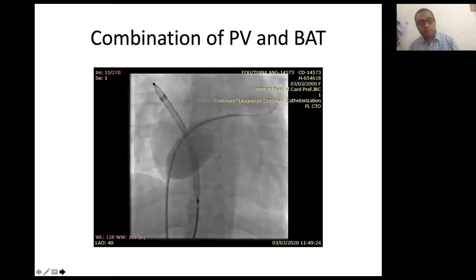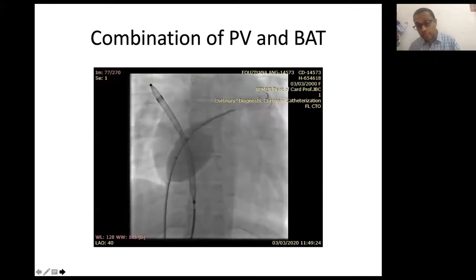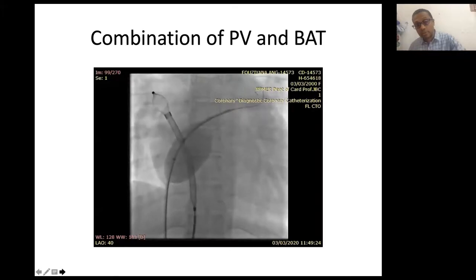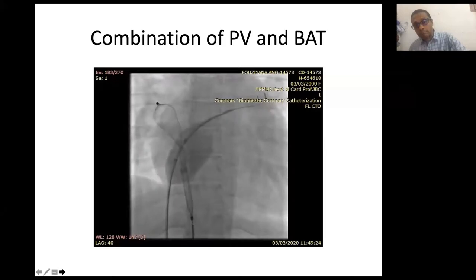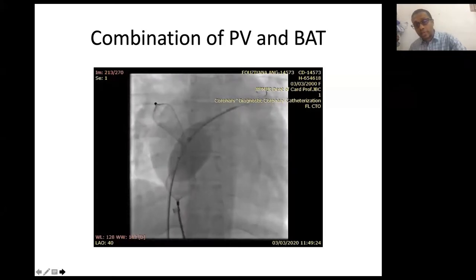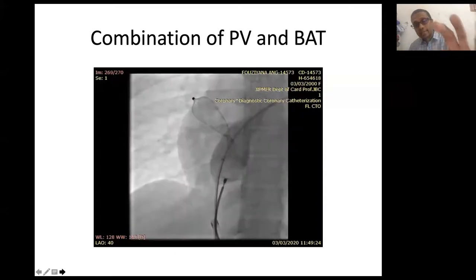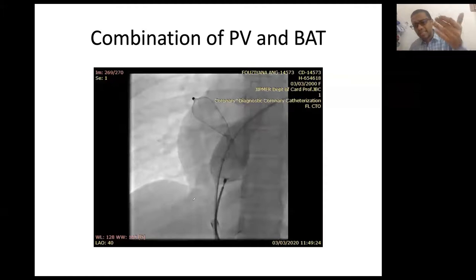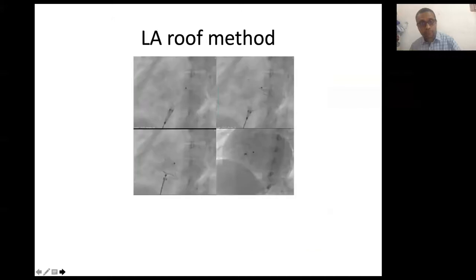The combination technique of pulmonary vein deployment plus balloon works especially in cases with deficient infero-posterior margin. The device is deployed in the pulmonary vein while a partially inflated balloon serves as a check — not to fully occlude or stretch the defect, but just to provide a restraint. The LA roof method is basically an extension of the pulmonary vein method and is particularly applicable when the LA is relatively larger compared to the device.